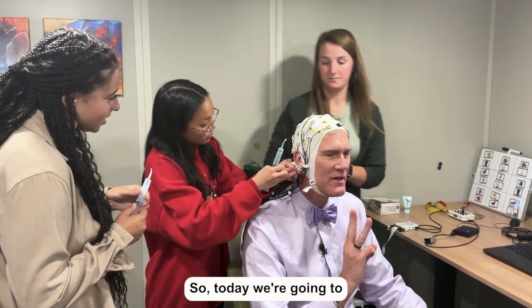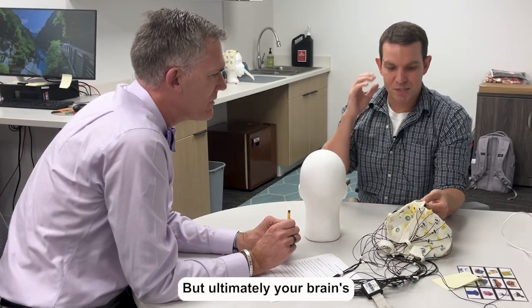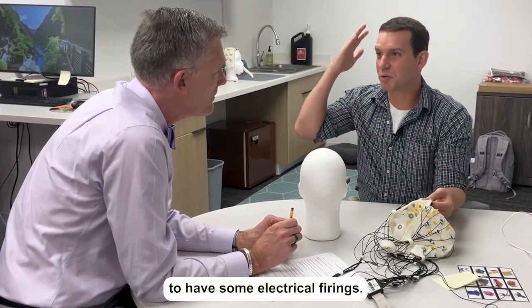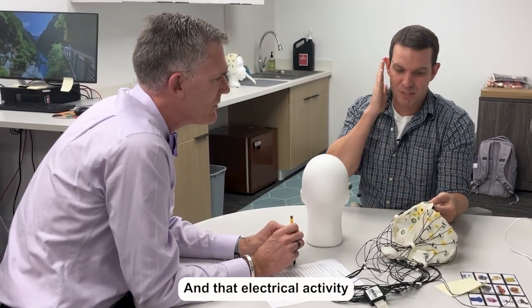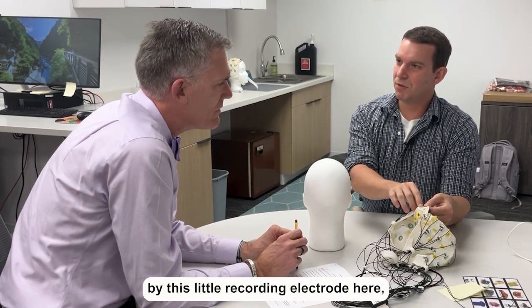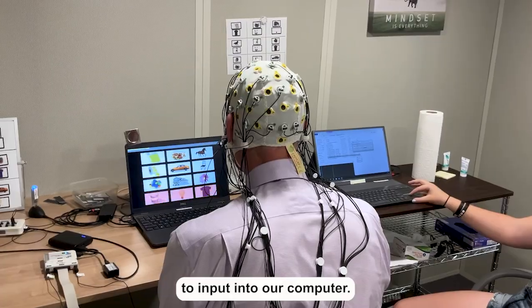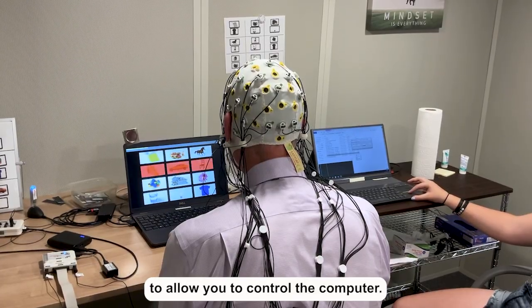So today we're going to wear a cap that's going to read some of your brain signals, but ultimately your brain's going to respond and it's going to have some electrical firings, right? Because that's what your brain does. And that electrical activity is going to travel from your brain through the scalp and ultimately is going to get recorded by this little recording electrode here, which is then going to input into our computer. And we're going to use that signal to allow you to control the computer.